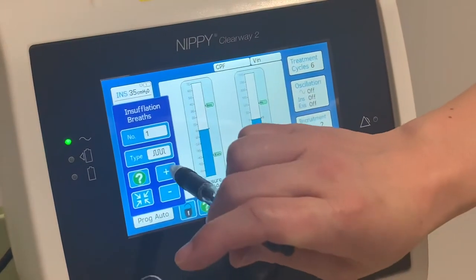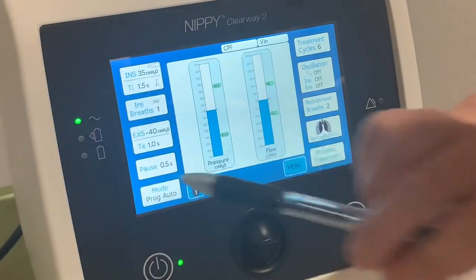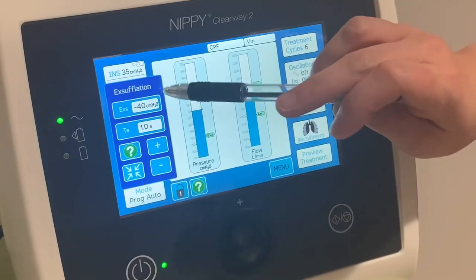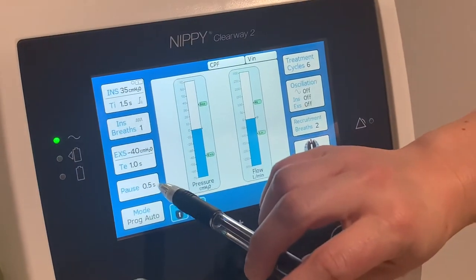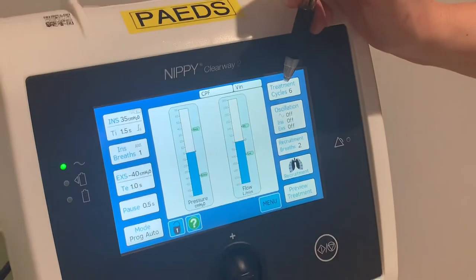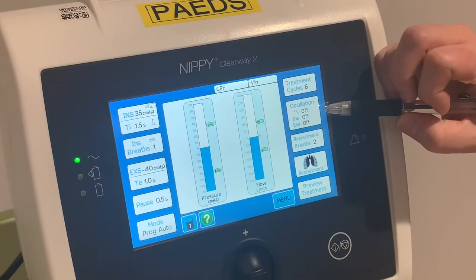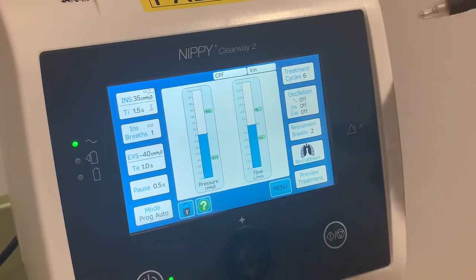Next is your inspiratory breaths — how many breaths you wish to give — and whether you want to breath-stack the patient beforehand. Then you have your expiratory settings, similar to the inspiratory, with your expiratory time to come out, your pause time, and up here is your treatment cycle — how many times you want the cycle to be completed.